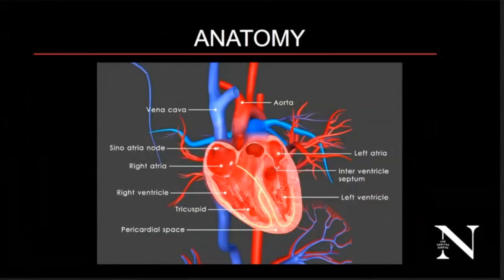Eventually, maybe today, you'll learn how to scan up and get the ascending aorta and get some measurements of that. Okay? The next step in your education, and I think you'll do this today, is to look at the valves. We'll teach you how to do that. Eventually, the coronary arteries, which is going to require increasingly good technology and resolution.